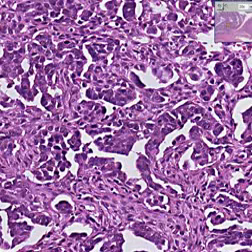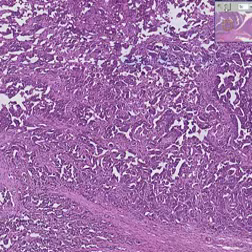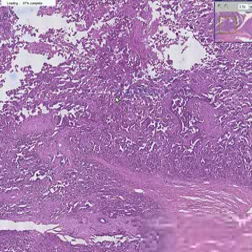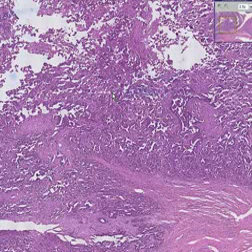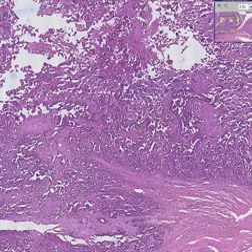And borderline is a good classification because you can't always predict how something is going to behave by virtue of how it looks. So this borderline classification is very justified. This is an adenocarcinoma of the ovary, a Mullerian-derived tumor, epithelial. In this case, there's not much mucin, so you could call it serous if you wish.